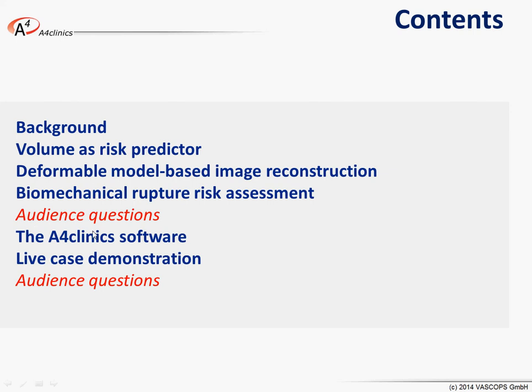After that, we're going to talk about the A4 Clinic software and see during a live case demonstration how this tool can be used to measure the volume of an aneurysm. That brings us to the second audience questions, which then will conclude our webinar.